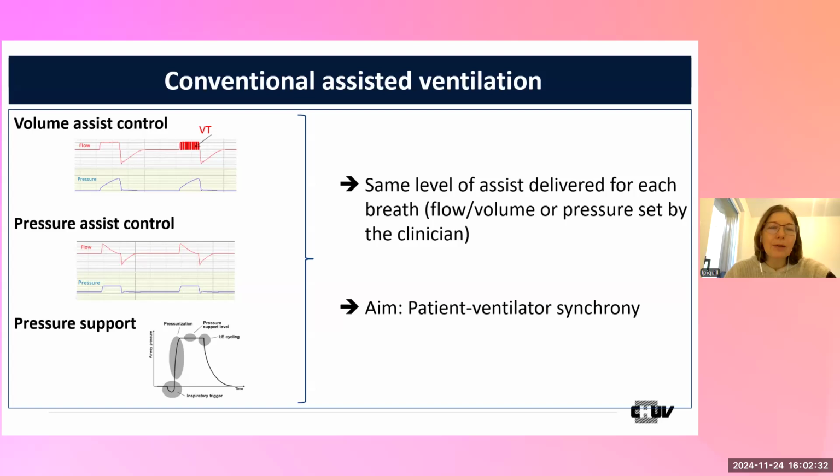And to start, I would like to say some words on what is conventional assisted ventilation, the ventilation we use every day. Under this word, I think we can put three basic modes: volume assist control, pressure assist control, and pressure support.